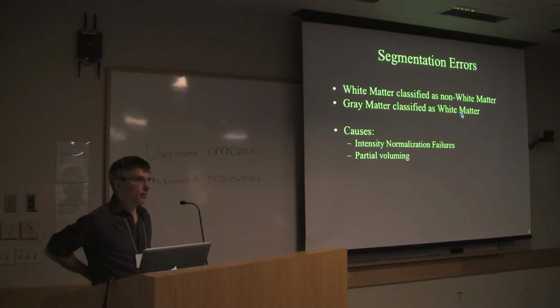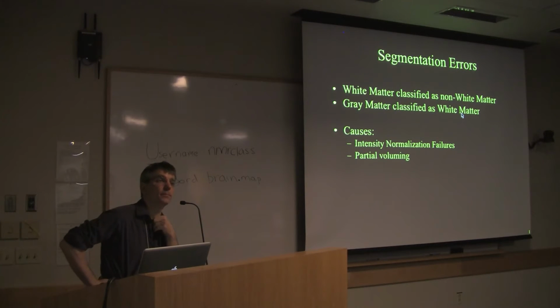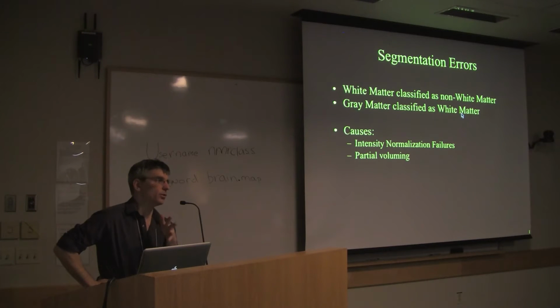So that was the first class of error, which are the skull strip errors. And so the skull strip can either, yeah, go ahead. What's the advantage of editing just a small portion, either cloning or taking away voxels, as opposed to just simply going in and adjusting the threshold? So what's the advantage of removing or adding voxels relative to just changing the threshold?